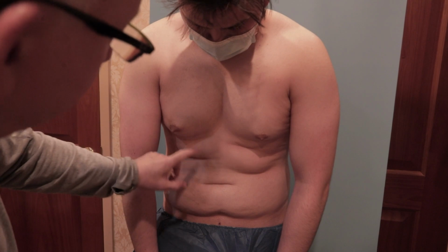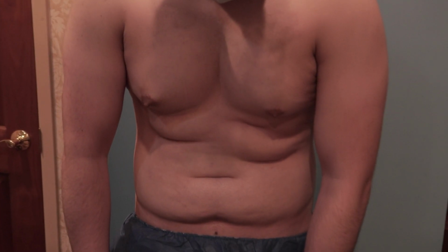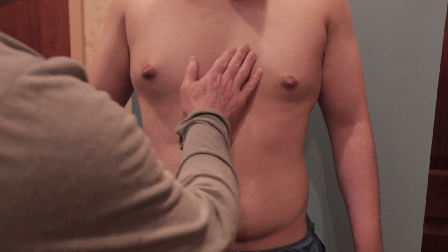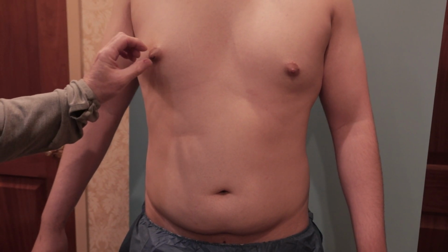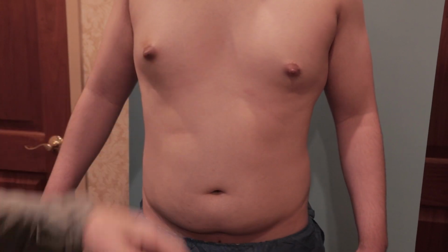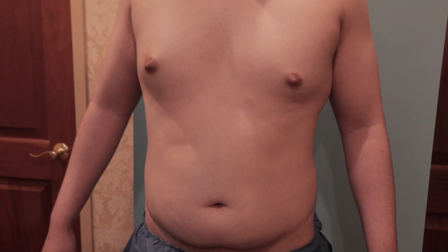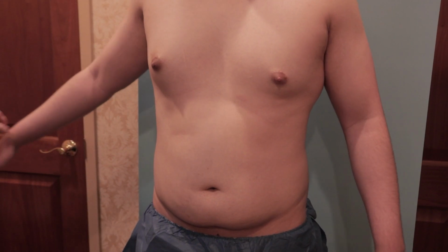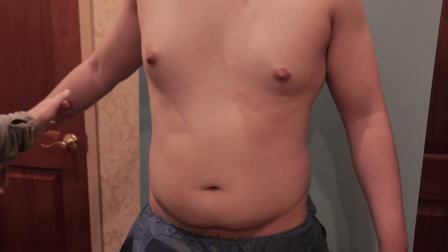For some reason, he's got asymmetry of these bubbles of fat and six-pack abdomen, so we're going to fix that and make it nice, a little bit hollow. Maybe he's got a little pectus excavatum on this side compared to this side. This nipple's a little bit bigger. We just discussed we're going to throw in a nipple reduction on both sides. Because if I do one side, he's going to come back and say, "Doc, I love this side now. I've got to fly from LA to you to do a nipple reduction." Which he could, but we're going to take care of it all at once.